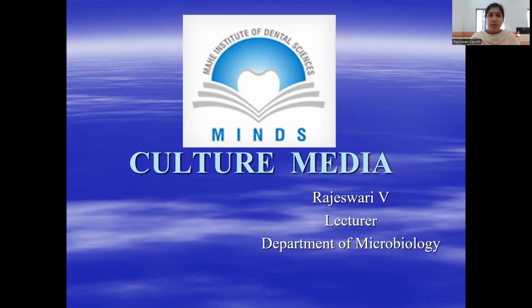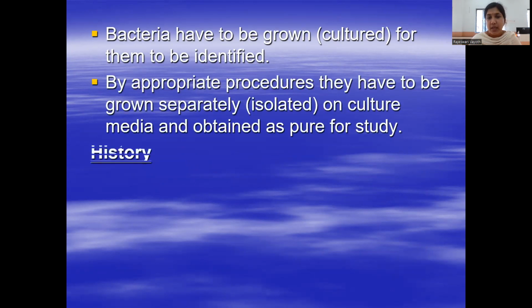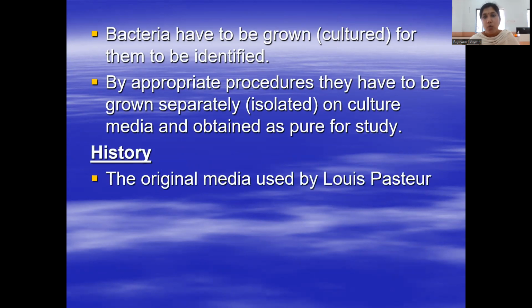Good morning, everyone. Today we are talking about culture media. What is culture media? Culture media is an artificial environment which is providing natural conditions for the growth of bacteria.